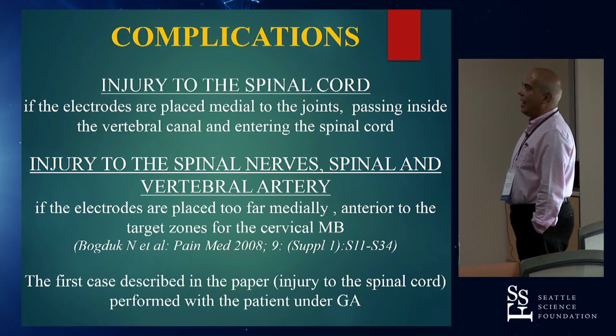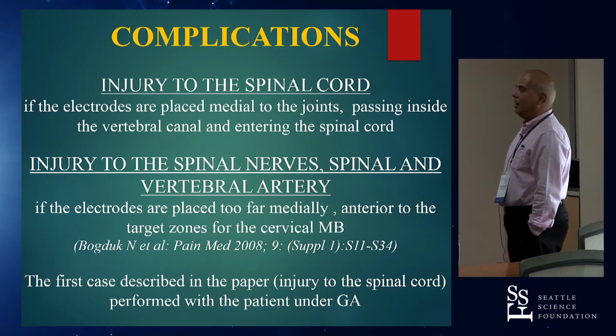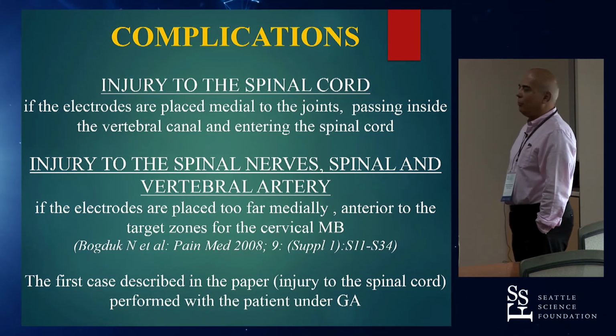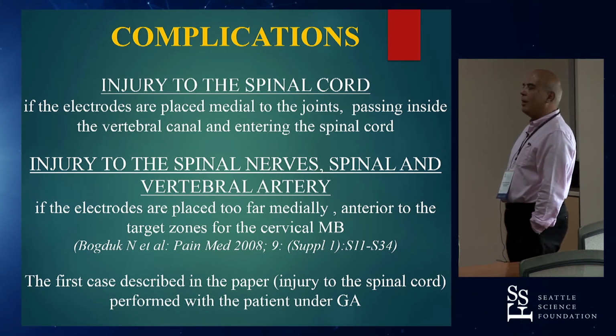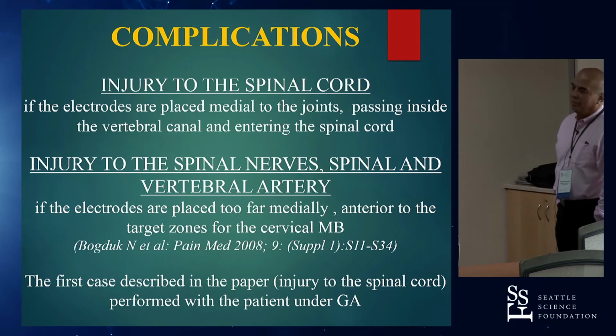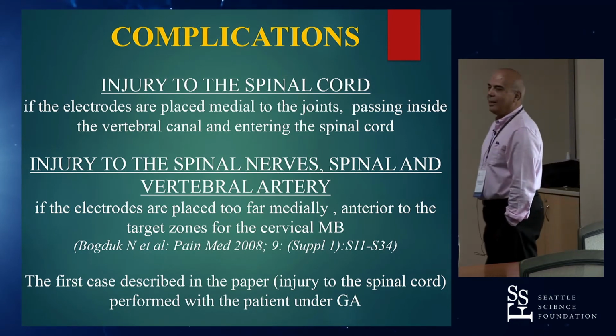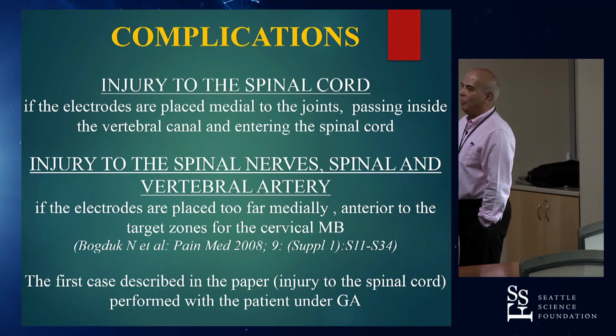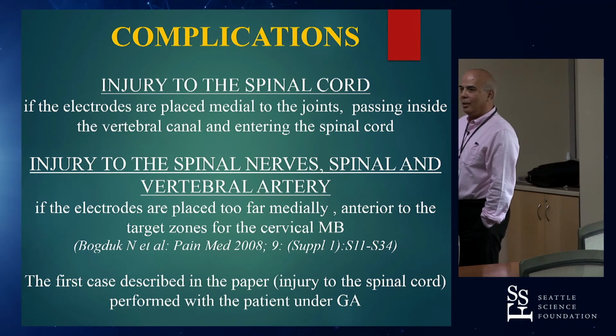These cases have been reported in 2008 in Pain Medicine, and actually the first of these two cases, the injury to the spinal cord, was performed with the patient under general anesthesia. It goes without saying that any of these procedures must not be performed with the patient under general anesthesia.